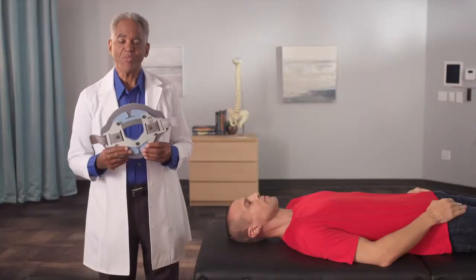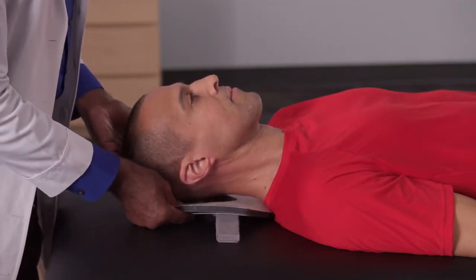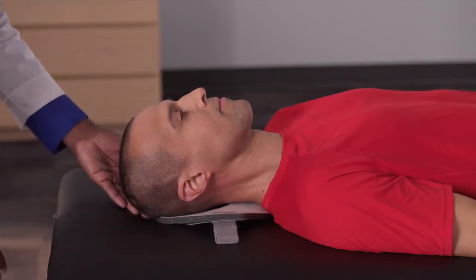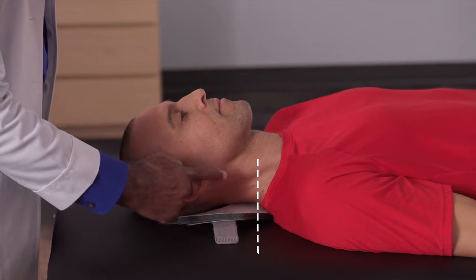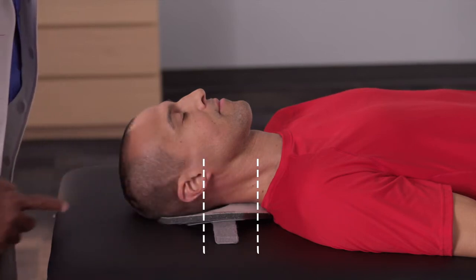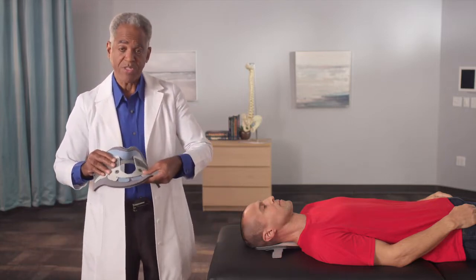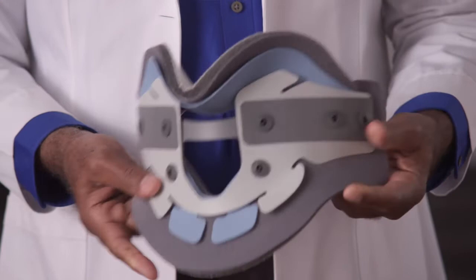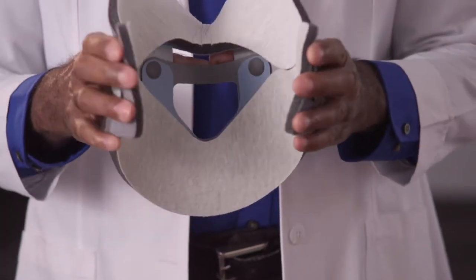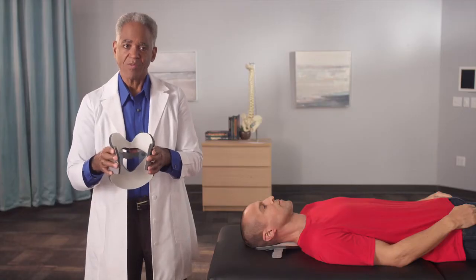We start the fitting with the posterior panel. Begin by positioning the panel under the patient's head and neck, ensuring that it's centered along the middle line of the head. Align the straps so that they are equidistant between the top of the trapezius and the bottom of the patient's ear. Take the anterior panel and bend the flex tabs out slightly prior to fitting. Take the back edges and bend them inward in order to pre-shape the collar to fit more snugly around the patient's neck.